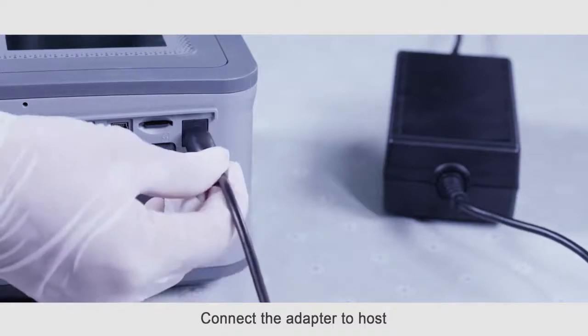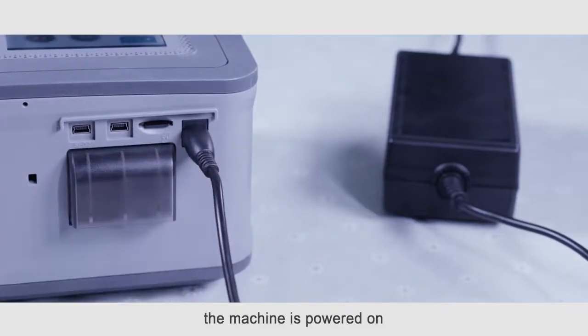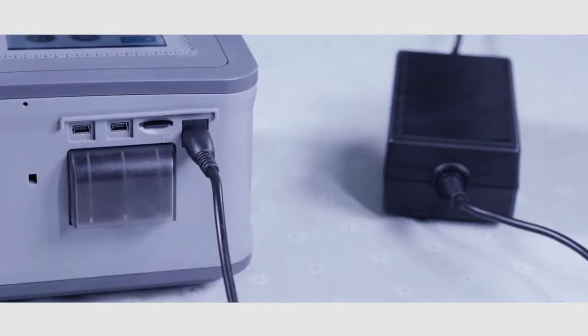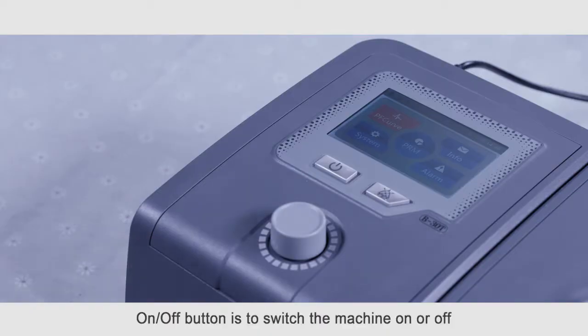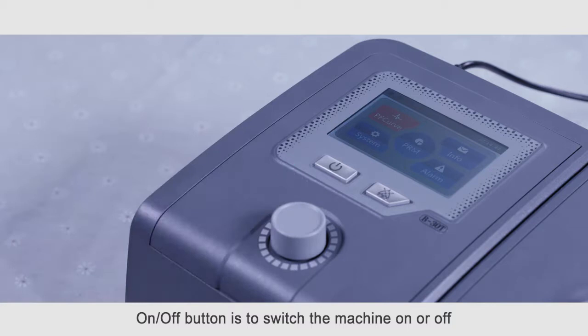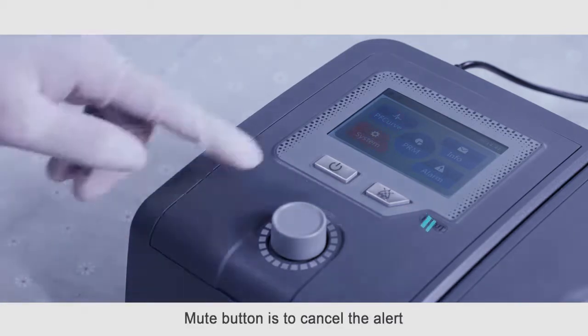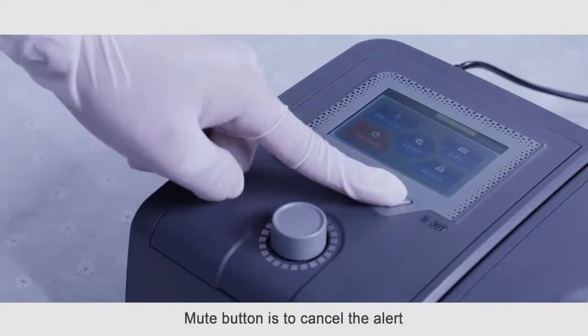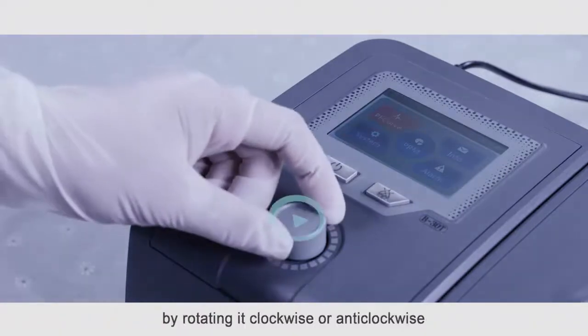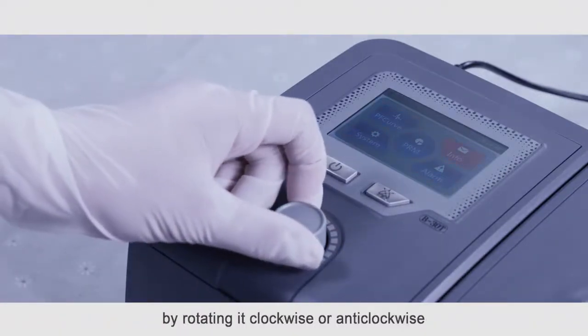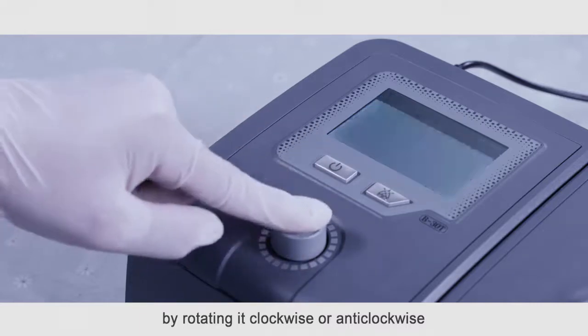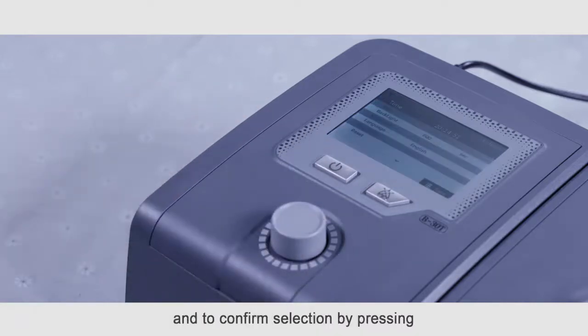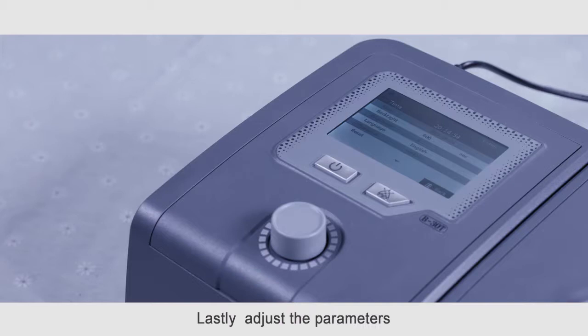Connect the adapter to host. The machine is powered on. You can find three buttons on the host. On-off button is to switch the machine on or off. Mute button is to cancel the alert. Dial button is to adjust the parameters by rotating it clockwise or anti-clockwise and to confirm selection by pressing.